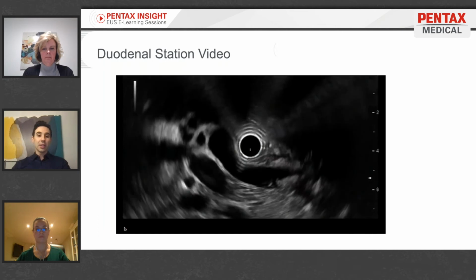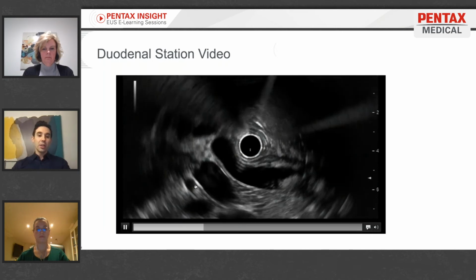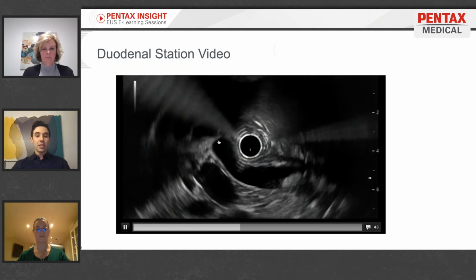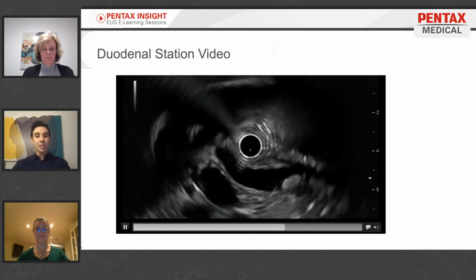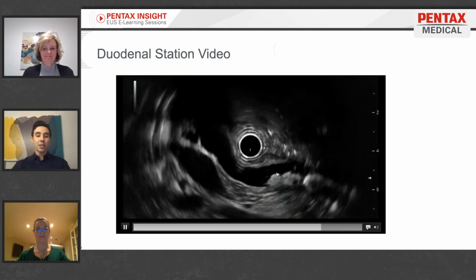So I'll have a black vascular structure here. This is the portal vein. This is the pancreatic head here. This is the common bile duct. And so this was my fellow who was scanning through, and he was very happy to find the common bile duct. He was thrilled, and I think he was ignoring the very large bright.